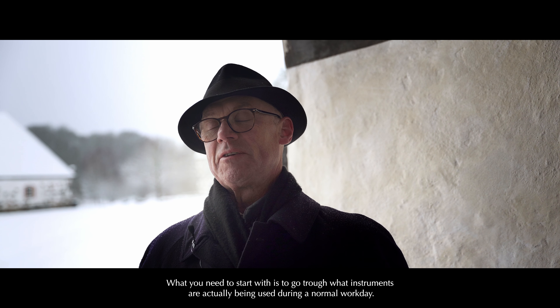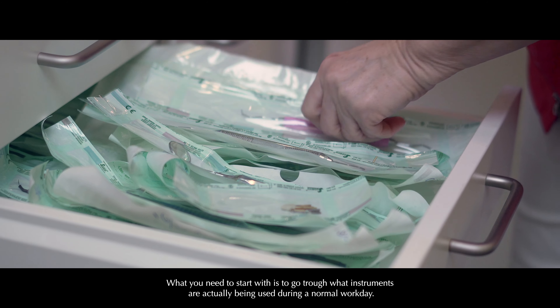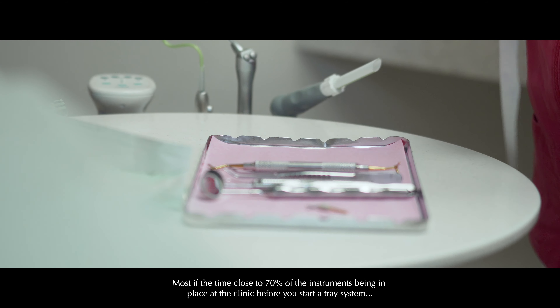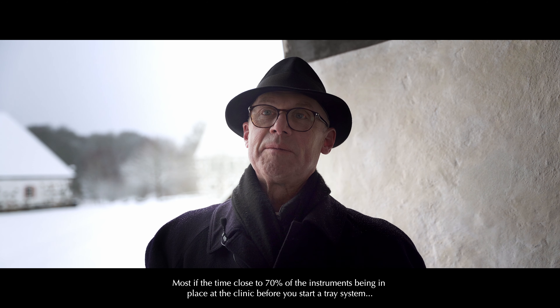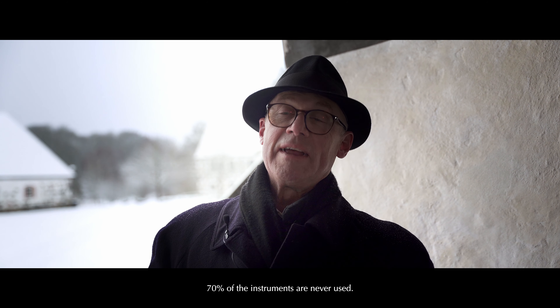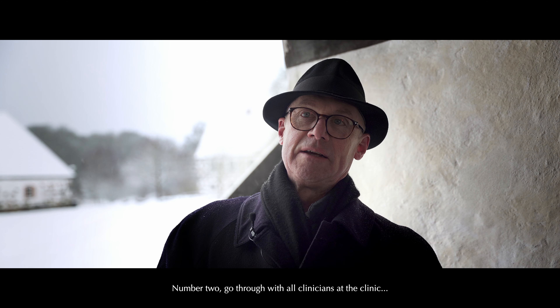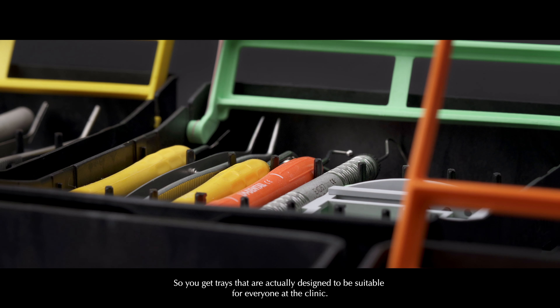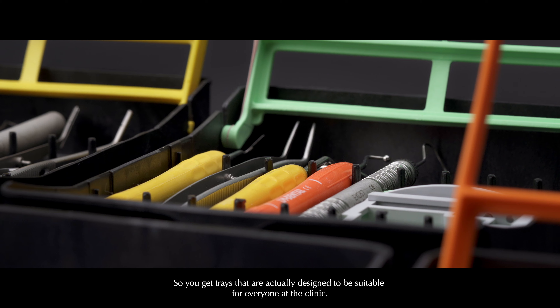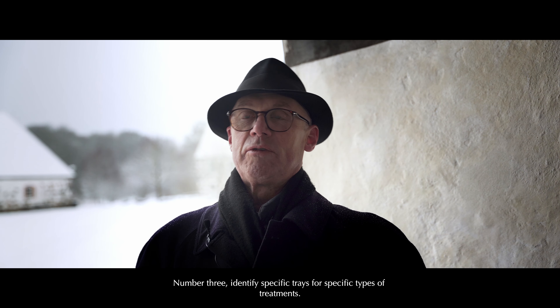What you need to start with at the clinic is to go through what instruments are actually being used during a normal workday. Most of the time, close to 70% of the instruments in place at the clinic before you start the tray system — 70% of the instruments are never used. Number two, go through with all clinicians at the clinic, so you will get trays that are actually designed to be suitable for everyone. Number three, identify specific trays for specific types of treatments.